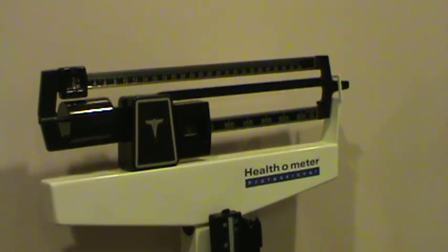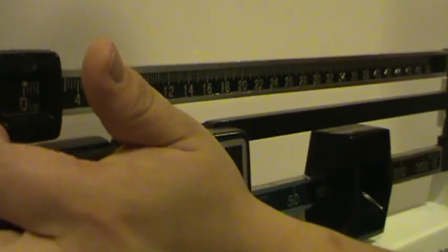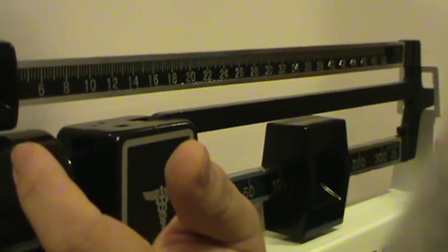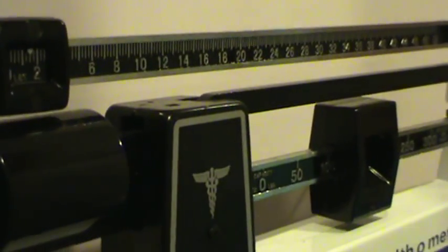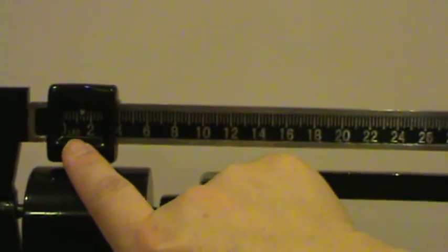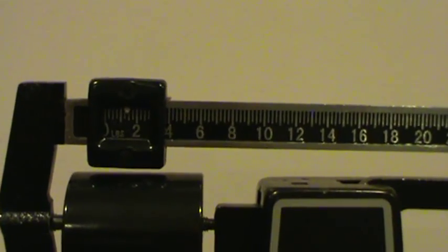Before you step on, the scale is at zero. Now, can you stand on it, sir? Very good. Make sure this part is in the middle. It's not touching the sides. Good. Mr. Smith, can you step up? Careful. Very good. Now, reading the scale — this is 150 here, and this is in between zero and two, so approximately one. So it's going to be 151.